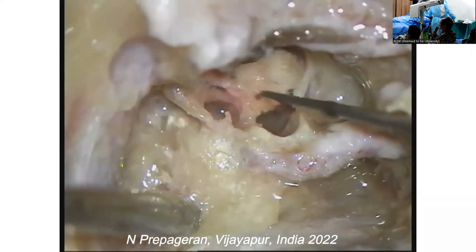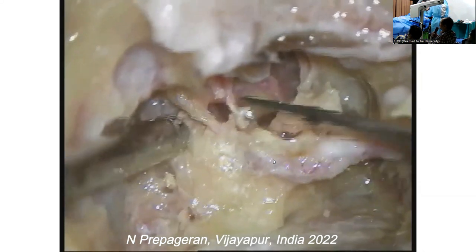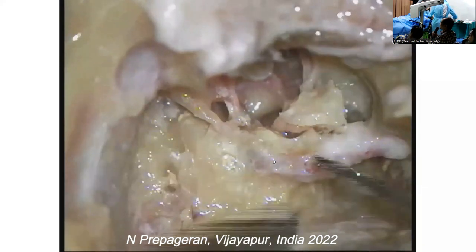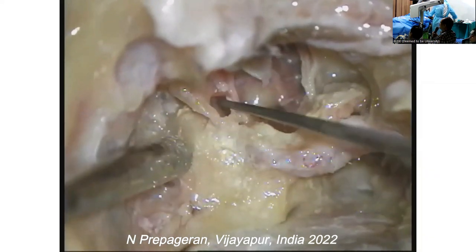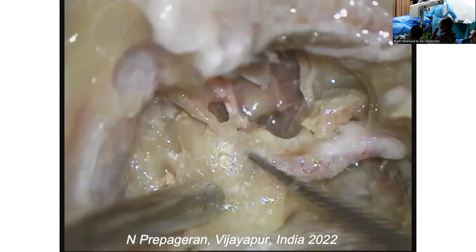Excellent, sir. Chorda tympani is there. Can you see the guys? Yes, that's a beautiful incudal pointer towards the facial nerve. The chorda tympani is so intact. That is your facial nerve. Here as well, the same way.